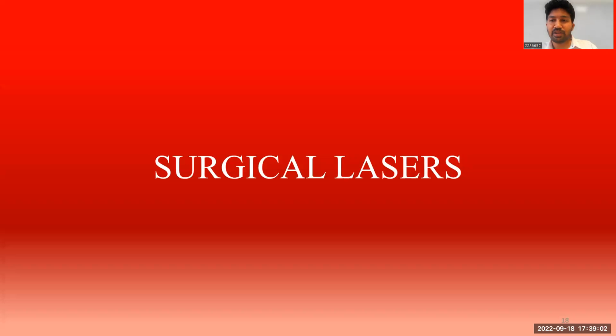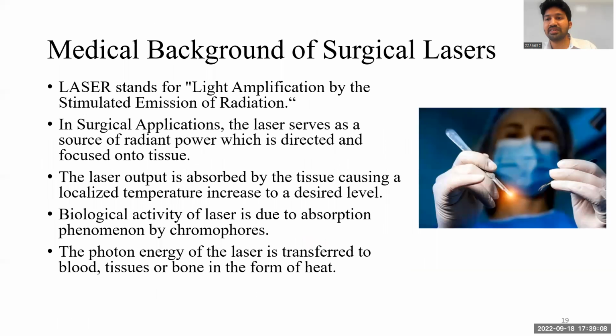Next, we can talk about surgical lasers, which can be considered the polar opposite of cryosurgery in terms of application. Laser surgery is a type of surgery that uses special light beams instead of instruments for surgical procedures. Laser stands for light amplification by stimulated emission of radiation. The laser serves as a source of radiant power directed towards the tissue, which increases the temperature of the tissue and destroys it.